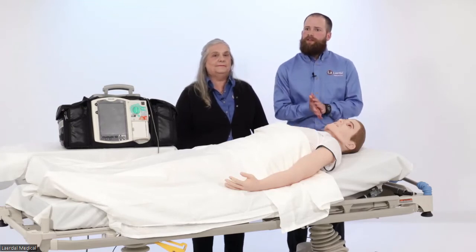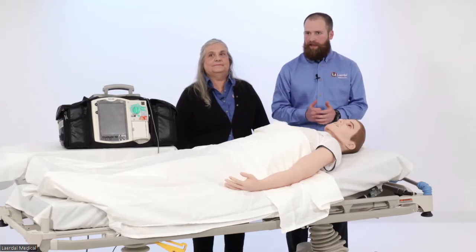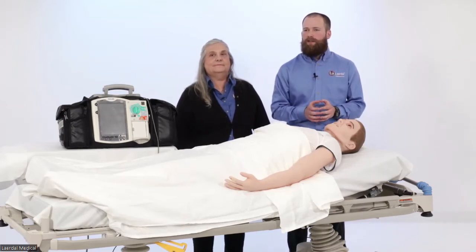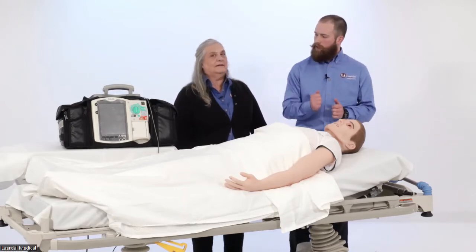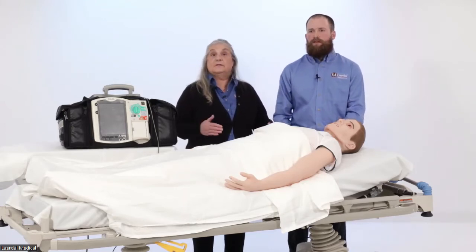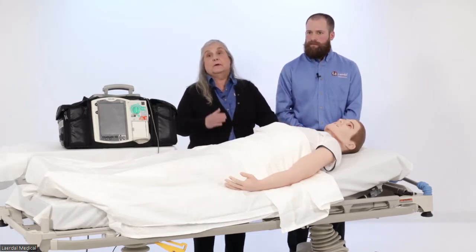All right, another question comes up on live shock. Since we are shocking with real live pads, does the simulator need to be grounded to discharge, or is there a built-in system that discharges the current? I believe you answered that one, but if you want to just rehash it for us. It's built into the system. It grounds right into the mannequin, and you don't need to do a separate grounding of the mannequin.